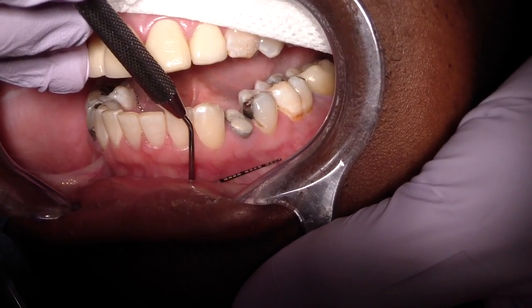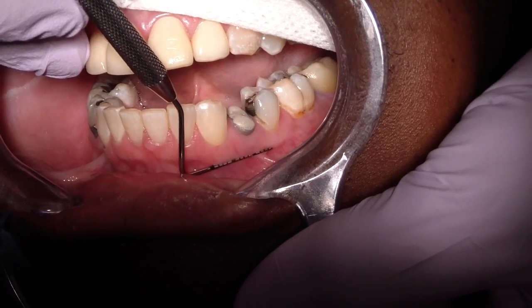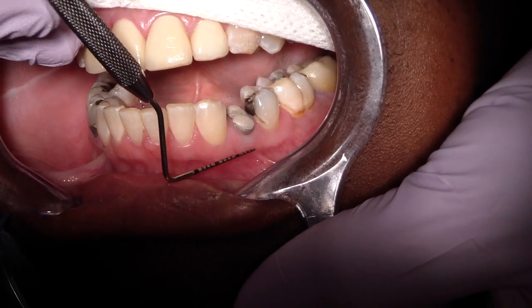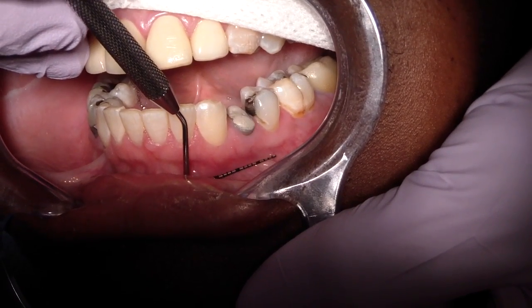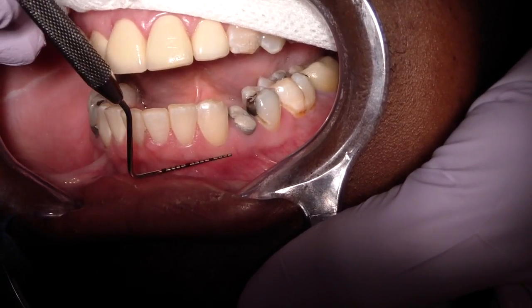What we're doing is just rolling the buccal mucosa — rolling the non-keratinized mucosa. You can see a delineation between where the attached gingiva and the non-attached gingiva is. You can easily see it in this case, but sometimes it's difficult.